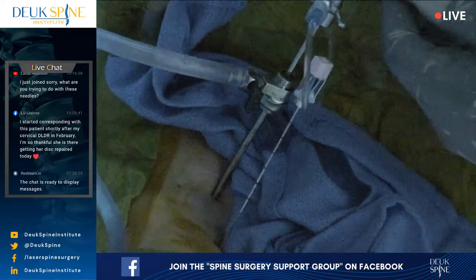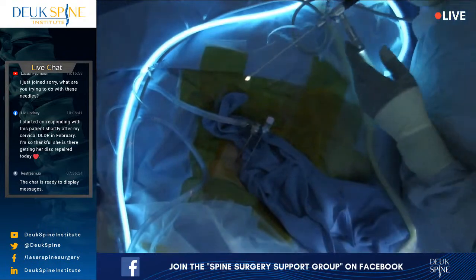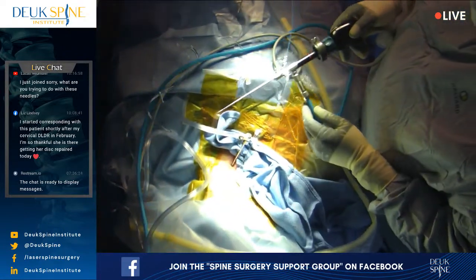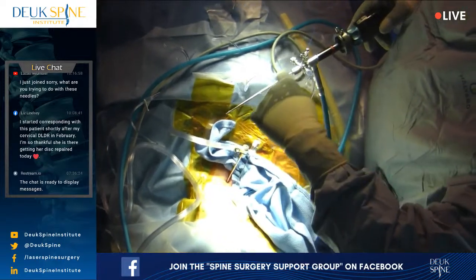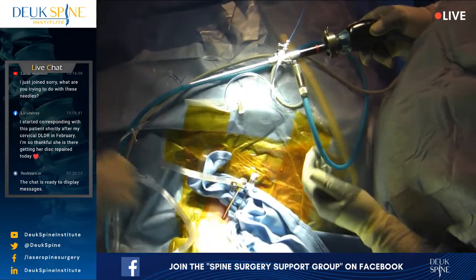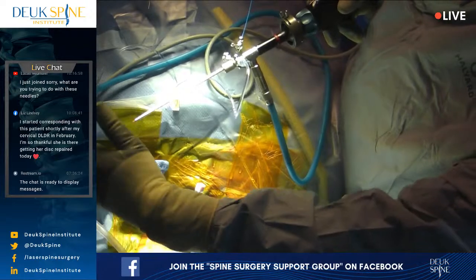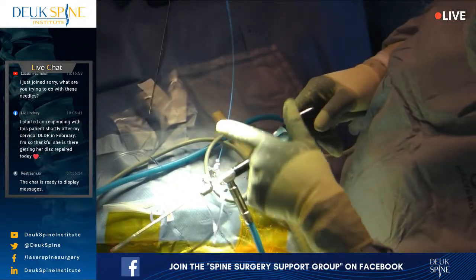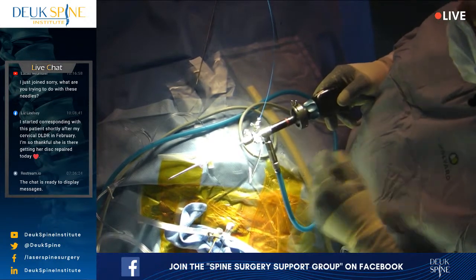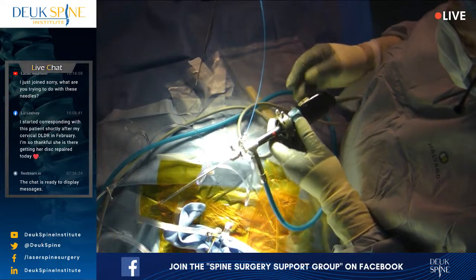Okie dokie. So now, let's show the audience the rig real quick before I go in. Can we show everybody? I know the patient's going to want to see it. Pretty cool, huh? So this is the endoscope itself. It's got a light source right here, which feeds light into the fiber optic system, and that brings the light down here. You've got your laser fiber here, which is 0.5 millimeter wide. You've got irrigation, which is cold saline irrigation, and we've got our high definition camera.